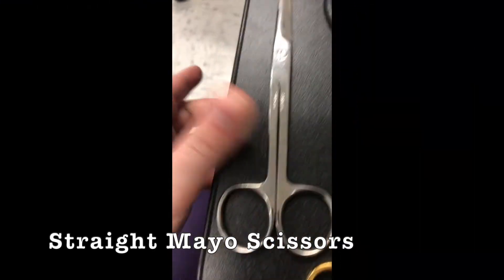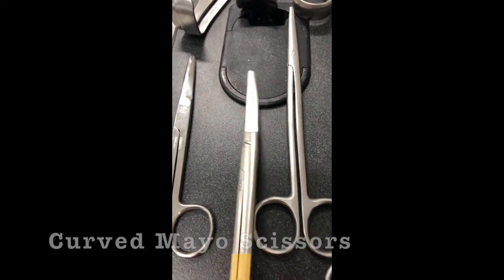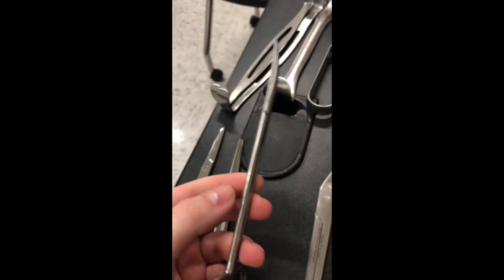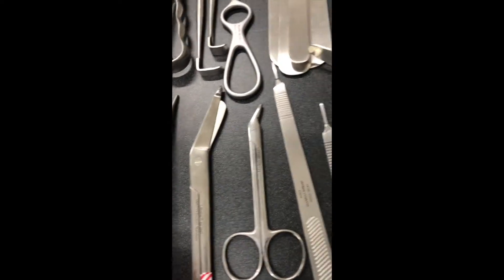It's the Mayo scissor — the straight Mayo scissor, then you've got the curved Mayo scissor, then you've got a curved or straight Metzenbaum. But aren't they generally just curved? Generally just curved, and they are more delicate.